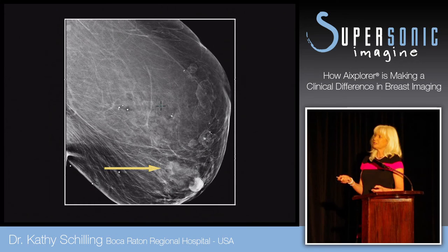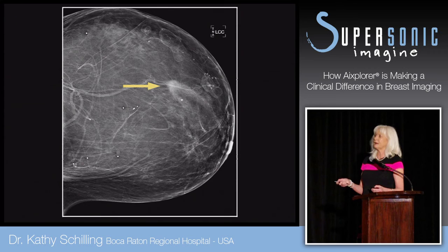Another patient had a large fatty breast. There's a large lipoma here. You can see part of the capsule. And there were multiple masses within this lesion that had peripheral calcifications. These were oil cysts. We saw a new density in the subareolar portion of her breast here, about 1 centimeter in size. That was better seen on the craniocaudal view, an ill-defined spiculated mass. The lipoma is situated here, and the oil cysts are seen anteriorly.